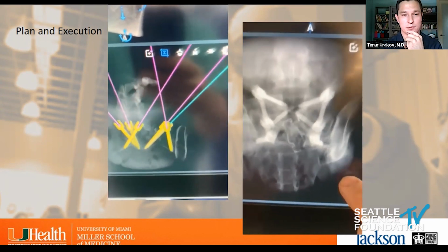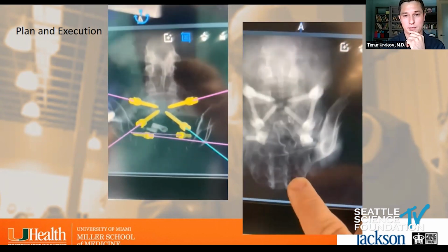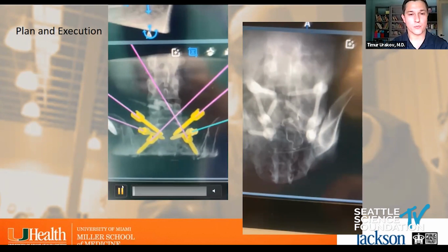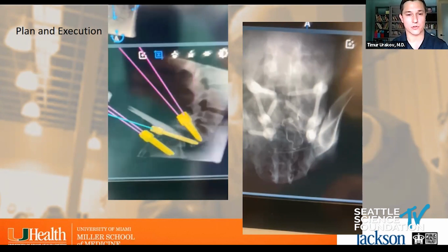I just want to have a straight line, a straight rod that can be passed along, and it goes in a very oblique fashion. You can imagine it's very deep in the patient and goes away from the surface. On the tricortical screw, the consideration should be when you look at it in the lateral, there's a limit to how much a tulip can accommodate with respect to the angle of the screw.